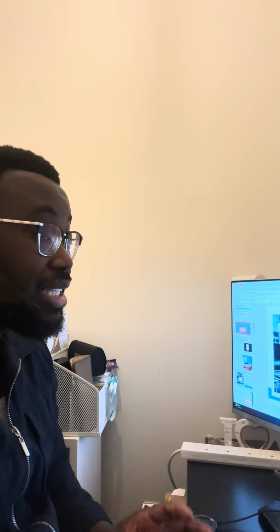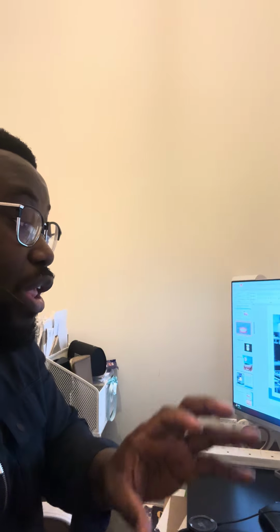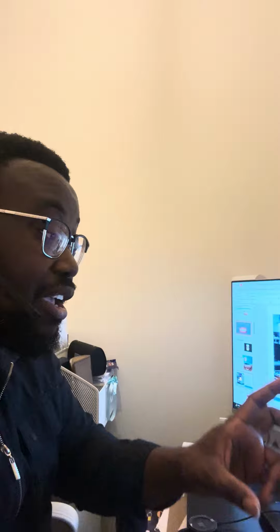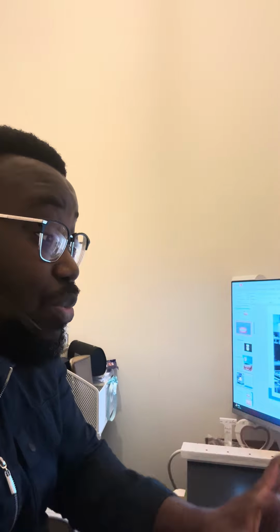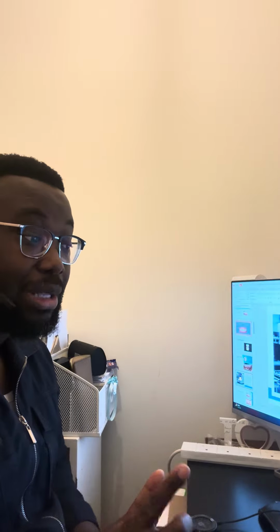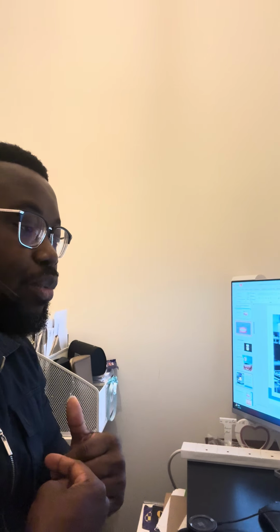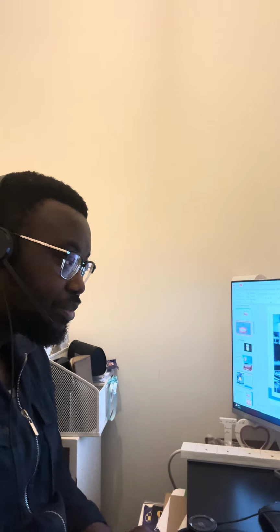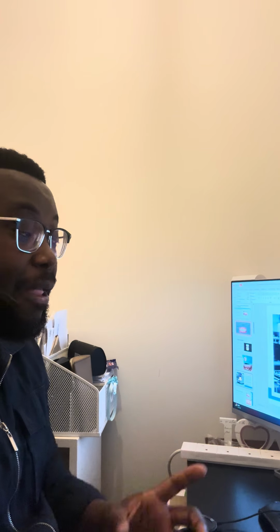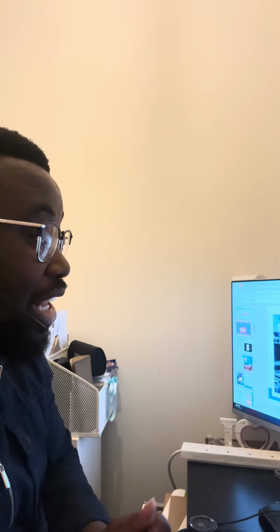of the patient. In fact, with 3D printing and also digital denture production, you can actually let the patient visualize the denture, agree with it first before it is actually produced. Okay, remember we talked about this when we talked about digital smile design, where the patient sees what their smile will look like before they go through the process of having that smile makeover.